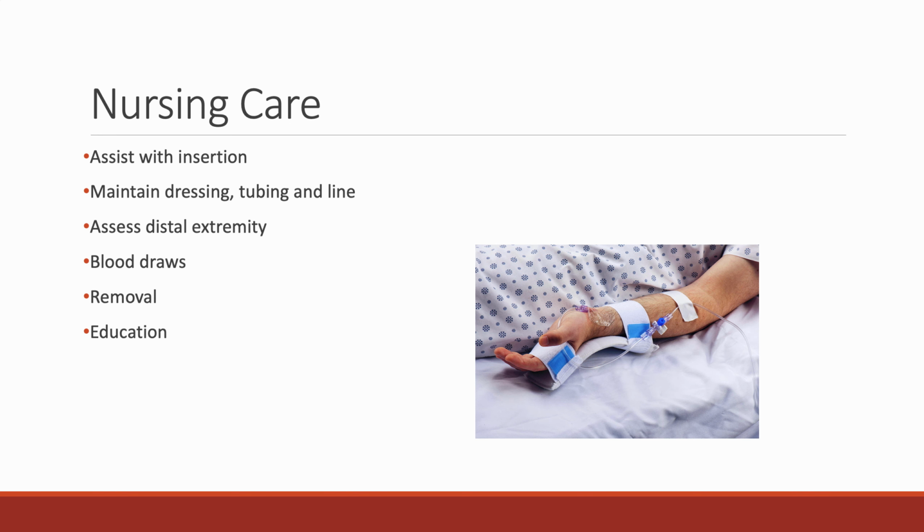Nursing care of the art line. So again, assist with the insertion, maintain the dressing and all that. You always want to check the pulses distally. Check the flow of and the tissue integrity distal to the arterial line. So you want to make sure that they have good circulation in the fingertips, essentially.